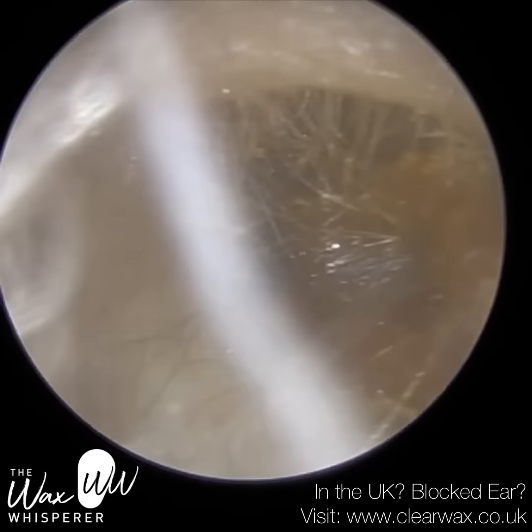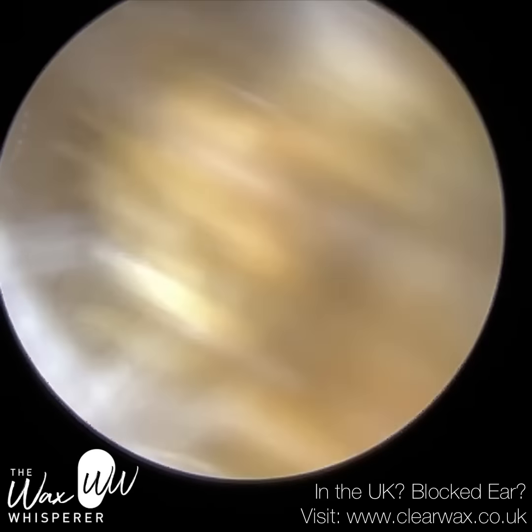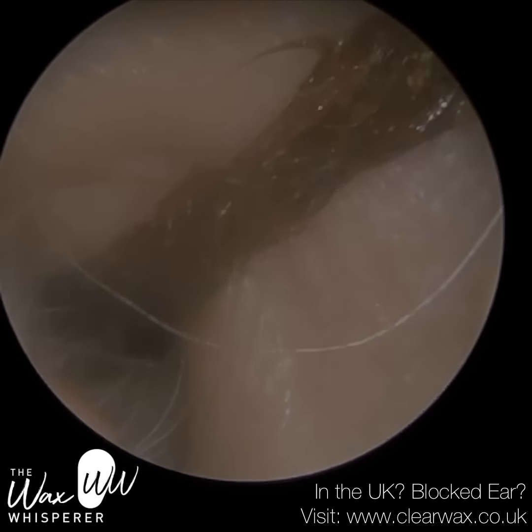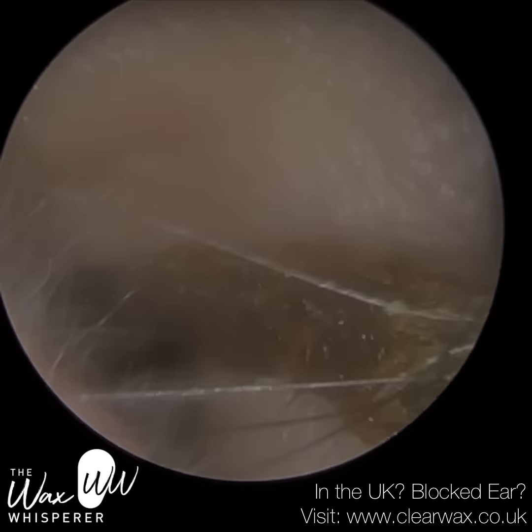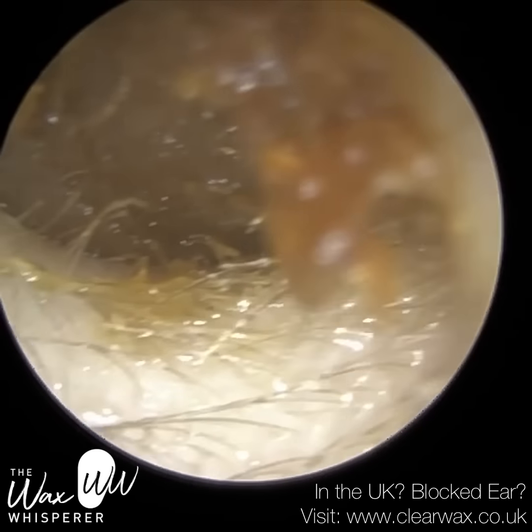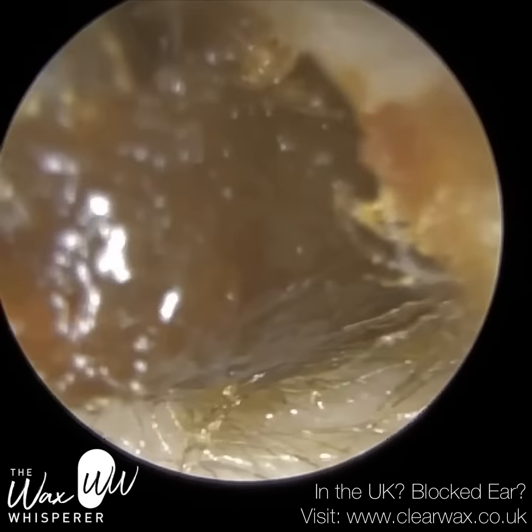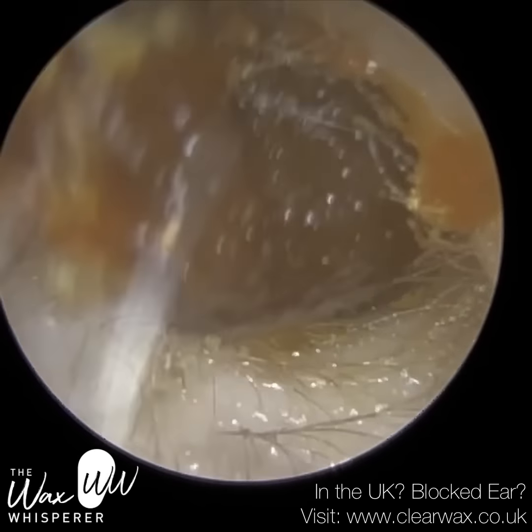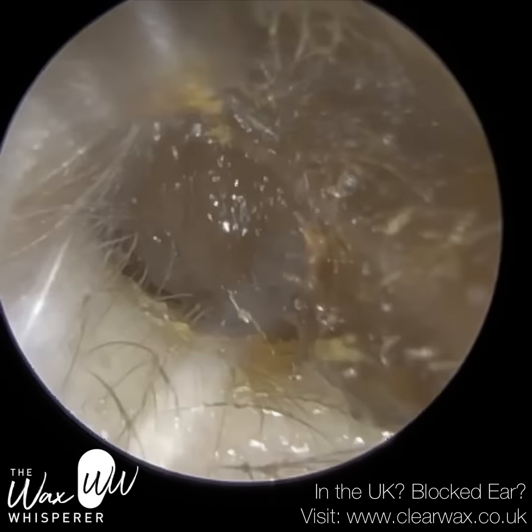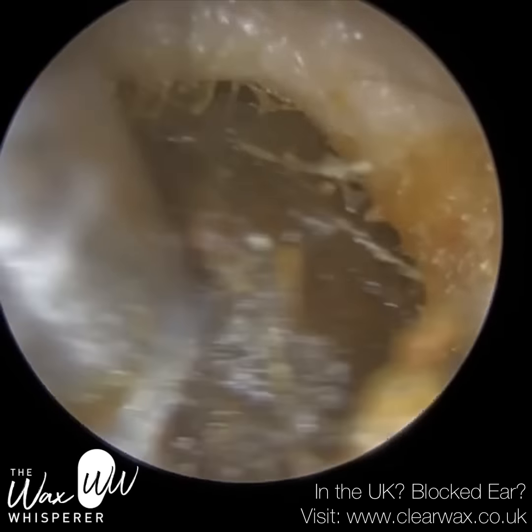This patient's ear canal was bendier than the first patient, and again, that's another plausible reason as to why they're getting an impaction in this ear. It was also narrower, and it's the first time in their life that they've had to remove wax. This could have been an accumulation for many, many years, but it was unbeknown to the patient. Ironically, what made the patient think they initially had some wax was because their husband had some wax removed a few weeks prior, and he said that it made such a big difference. The patient then wondered whether they had wax, and they became more aware and attuned to their hearing, or their lack of hearing in this case, in this left ear.